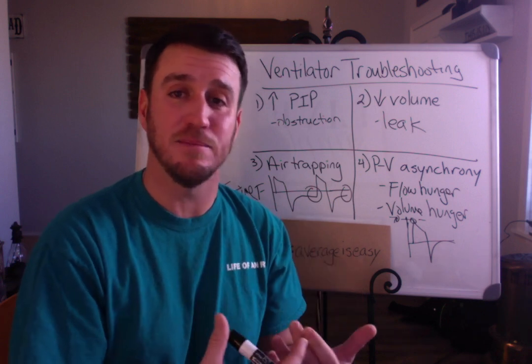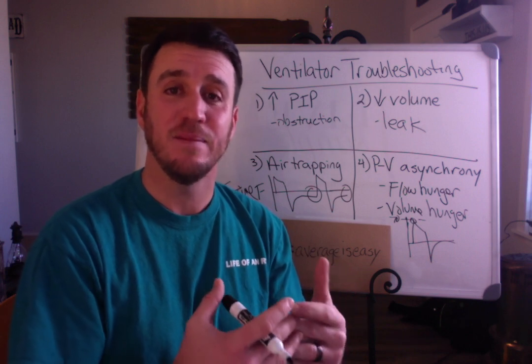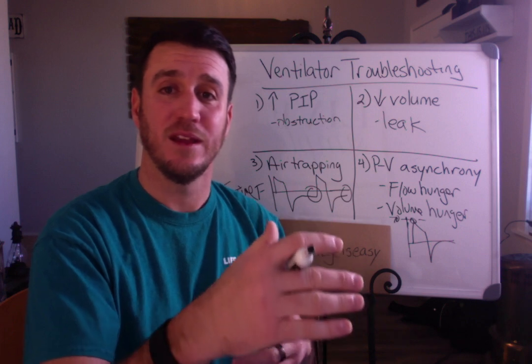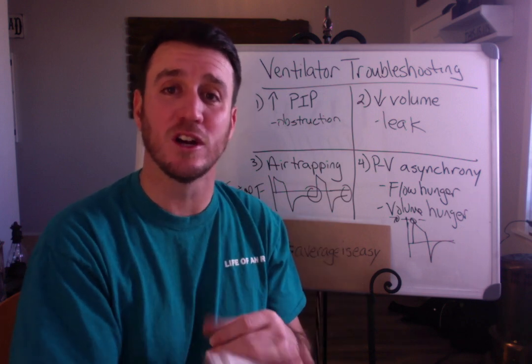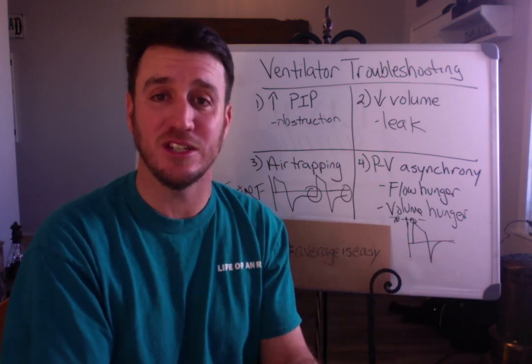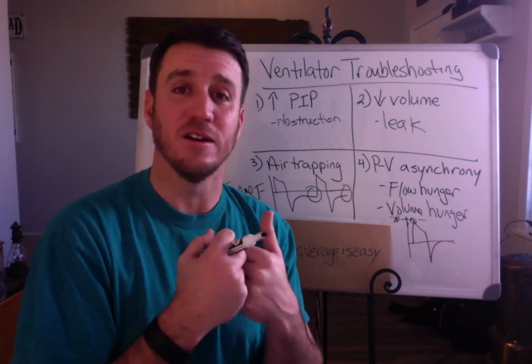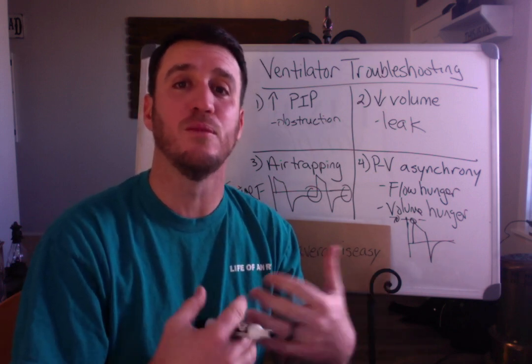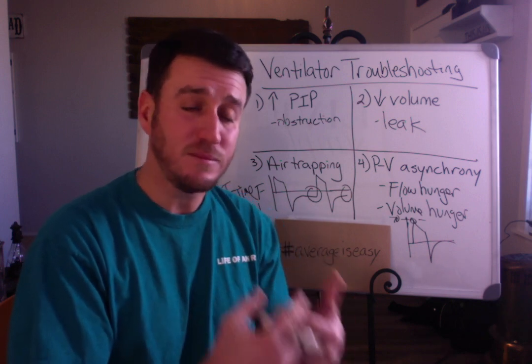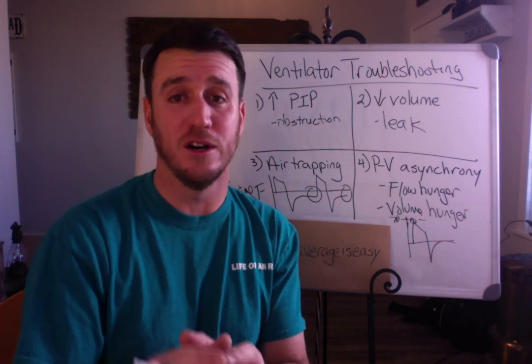You've got to present this in a manner that gets through to your physicians to say, hey, if I increase the tidal volume to 475, guess what? They're not going to ask for more volume, because we're going to be meeting their demand. We're going to be satisfying the patient, making them more comfortable. Right now, they're not comfortable. They're angry. They're hungry for more volume. And so let's give it to them. So that's the first thing. That's the second thing when it comes to volume hunger.